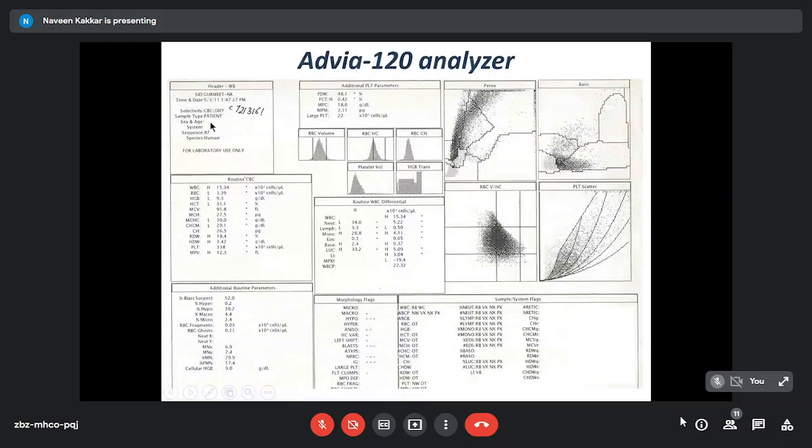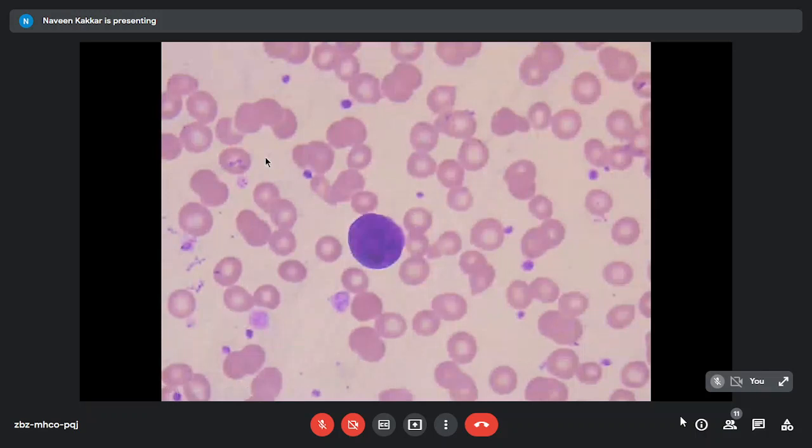Now, this is the case that I'm working on next. This is a patient with myeloproliferative neoplasm on follow-up. The TLC is 15,000, hemoglobin is 9.3, platelets 338. And on the differential, it gave us a large unstained population of 33.2. If you can see, this is the lymphocyte area, with fewer neutrophils. But in this area, the population that the arrow is pointing to was 33.2. So looking at the scatter plot, I feel there are blasts coming up in this patient. And we know MPNs can transform to acute leukemias. But the smear showed something else.